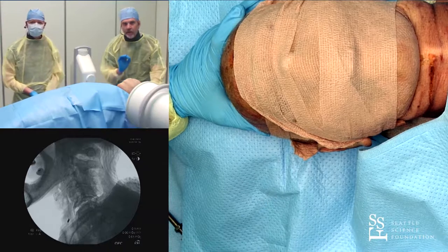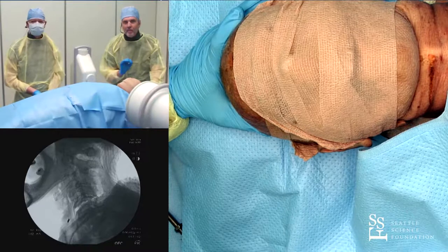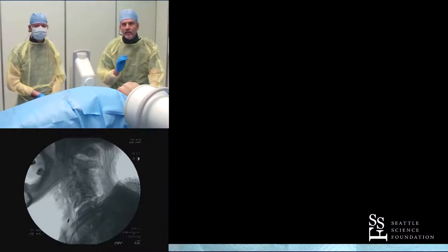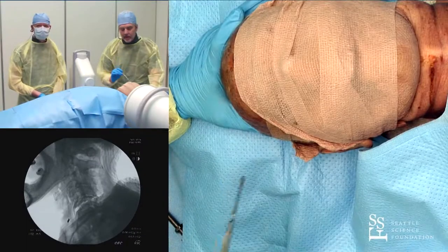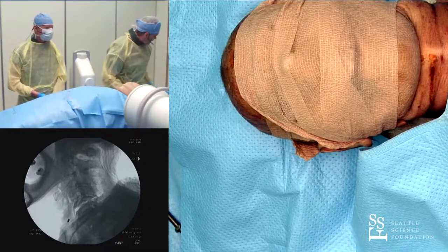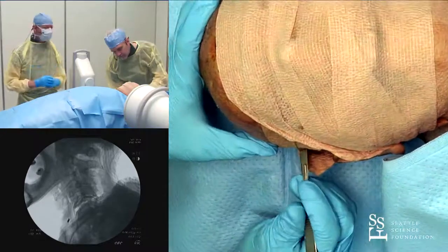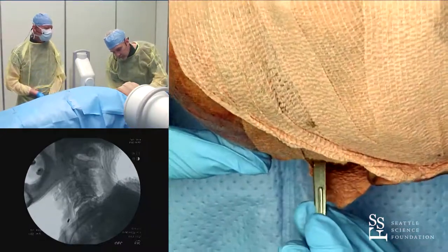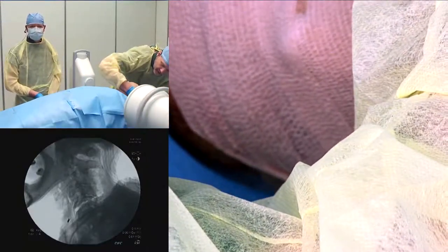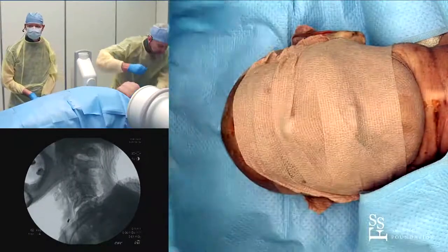I'll use a small stab blade — like a 15 blade — to make a small incision in the scalp, just to help entry and confirm the patient is anesthetized. My colleague differs: he does not use a scalpel. He raises the wheal, goes straight to the periosteum, puts a lot of local there, and places the sharp pins in directly without a scalpel incision.